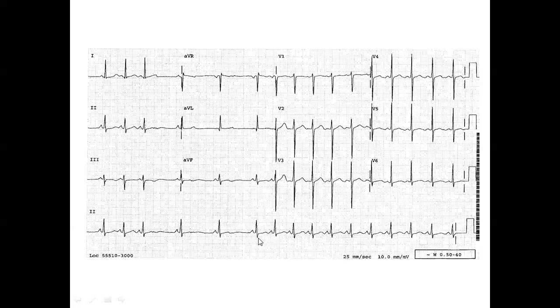Another interesting situation, perfectly regular sinus rhythm. Then pause. You try to make, what is this pause made of? Can you put 2 of this in here? Yes. So another example of a type 2 SA block.